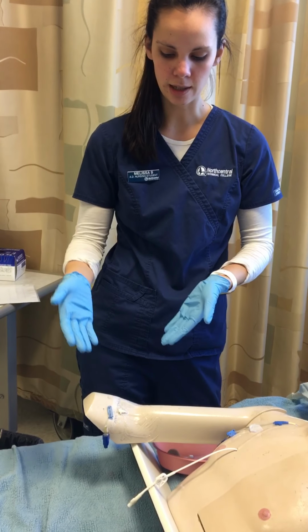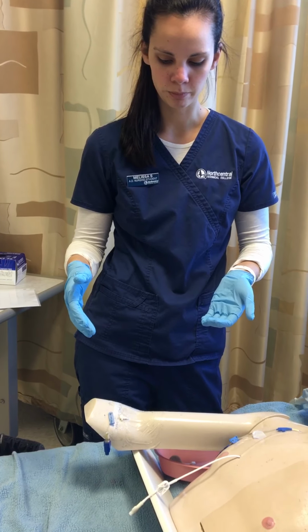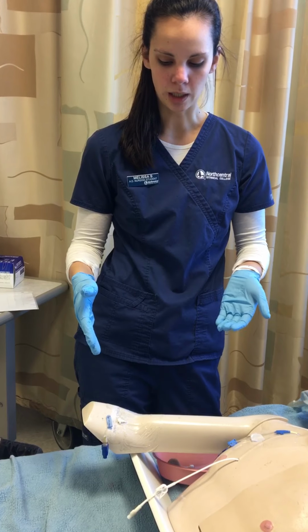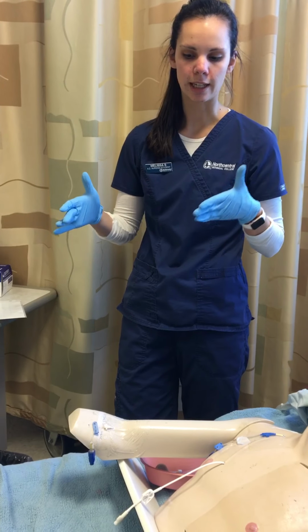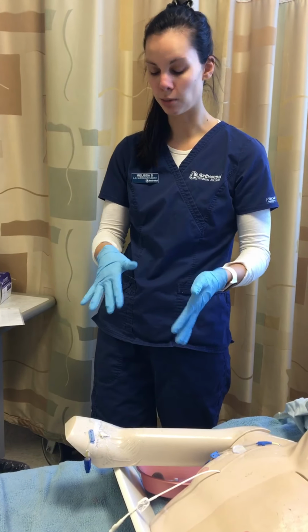If there was a heparin flush per my facility protocol, I would withdraw the heparin before I started giving my med. She's getting long-term antibiotic therapy, so she does still require the PICC line.